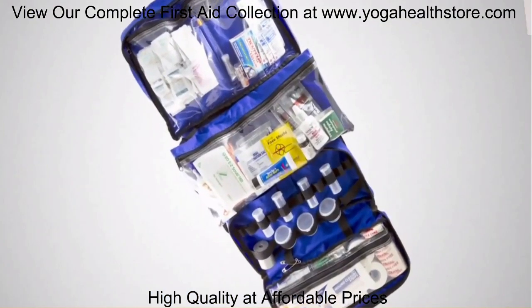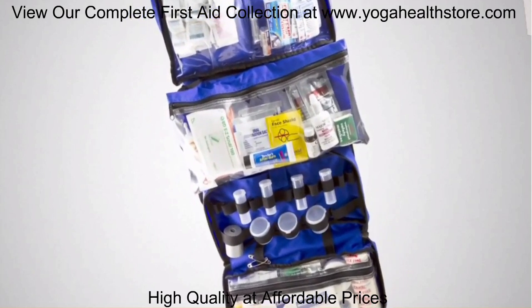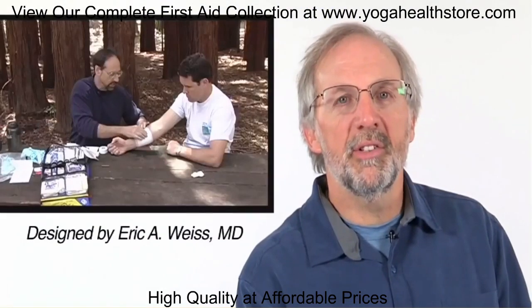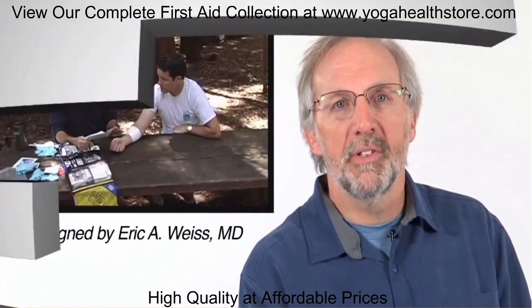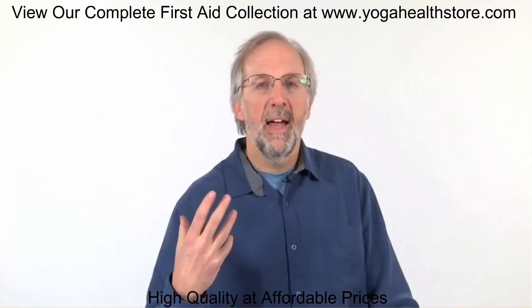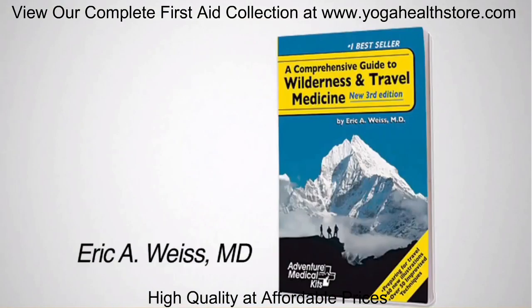Dr. Weiss designed this kit. Dr. Weiss is an emergency professor of medicine at Stanford University Medical Center and one of the original doctors for the Wilderness Medical Society. He understands environmental and wilderness emergencies and served at the Everest Base Camp as a physician. He takes all that experience and knowledge and puts it inside of this kit, and wrote the book, A Comprehensive Guide to Wilderness and Travel Medicine, that tells you how to use all the supplies.